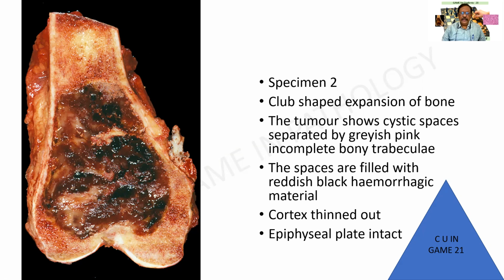Please write this description. It will be a specimen for you and the microscopic picture a definite slide for undergraduate students.